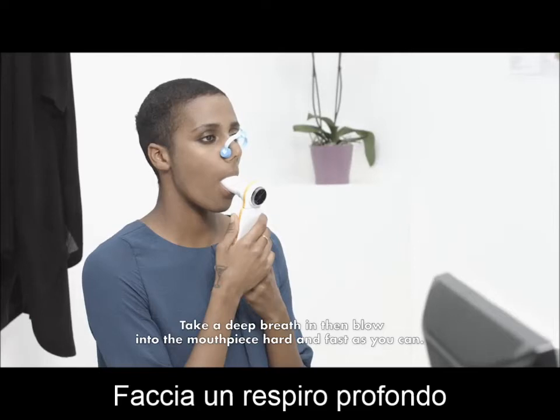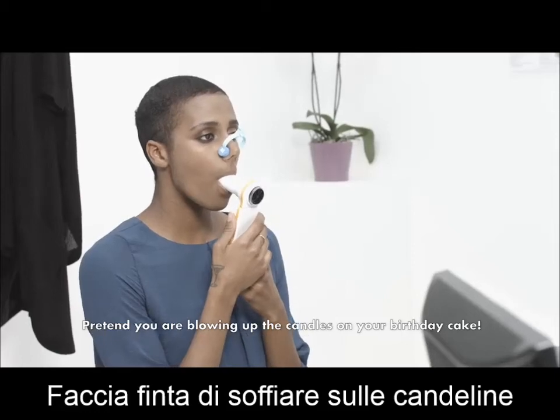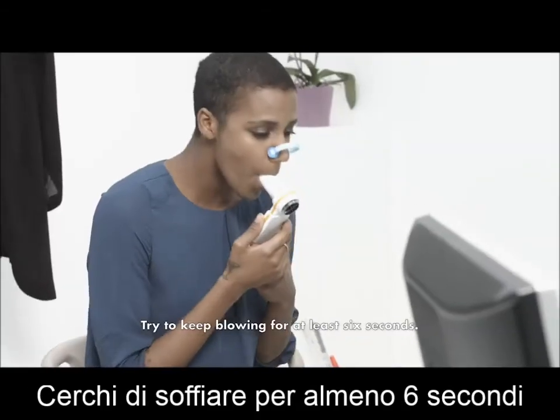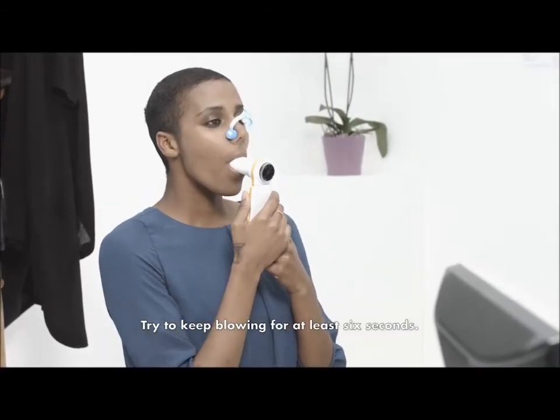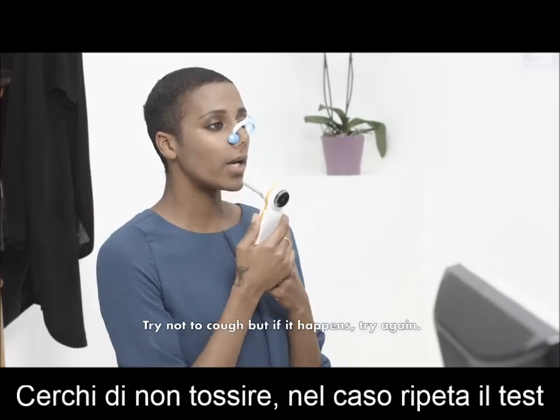Take a deep breath in, then blow into the mouthpiece hard and as fast as you can. Pretend you are blowing out the candles on your birthday cake. Keep going — try to keep blowing for at least six seconds. At the end, take another deep breath in. Try not to cough, but if it happens, try again.